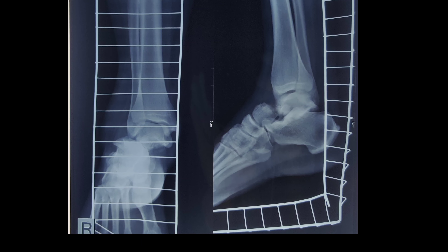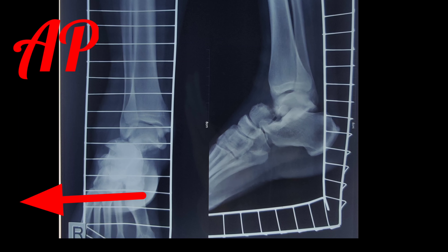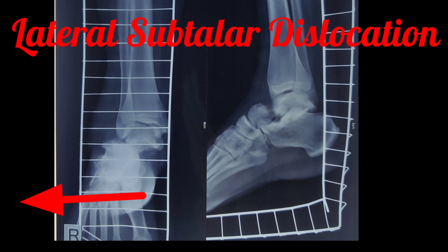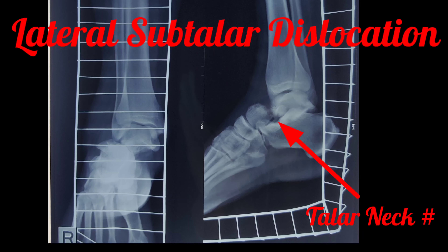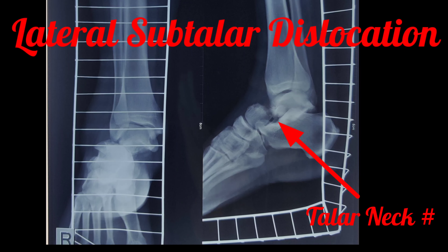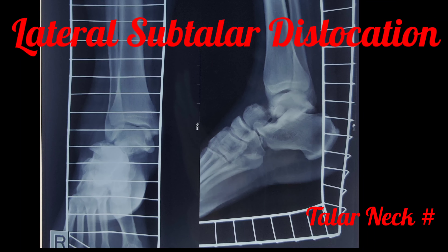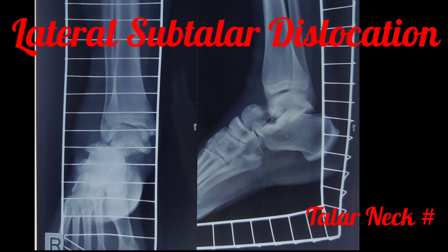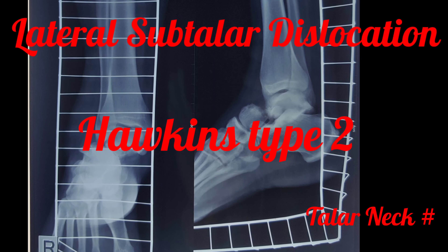In the AP view we can see that the foot has moved laterally in relation to the talus, making it a lateral subtalar dislocation. In the lateral view we can find a talus neck fracture. So it is a displaced talus neck fracture with subtalar dislocation, making it eligible to be classified as Hawkins type 2.